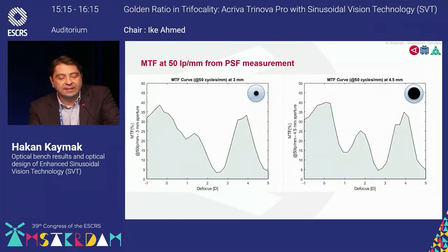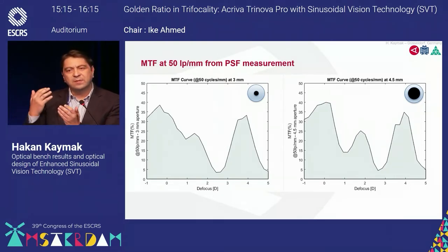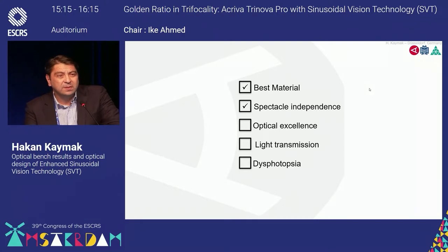You can see it again, the trifocal profile. It's a little bit less with the small pupil. That means you can save energy because you have a little bit of depth of focus with the small pupil, and for the larger pupil, you can see the trifocal profile. That means we checked it. We have also the spectacle independence in the laboratory.